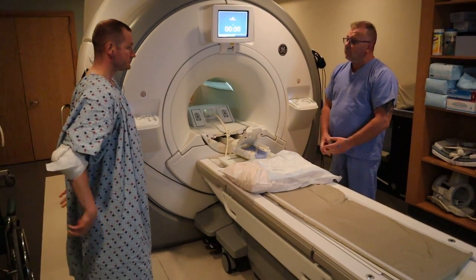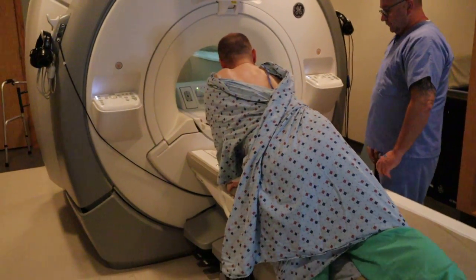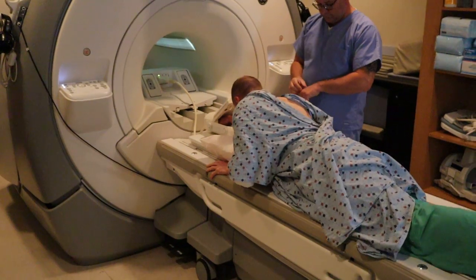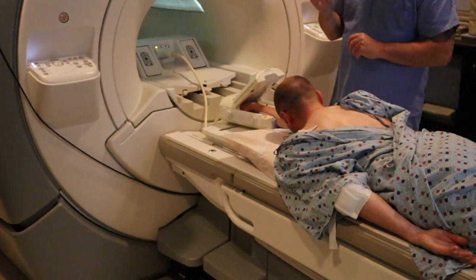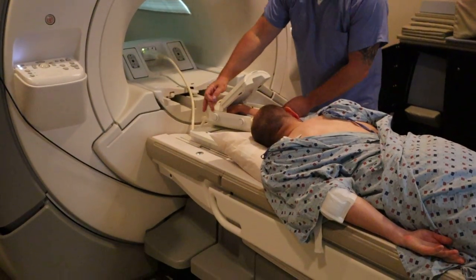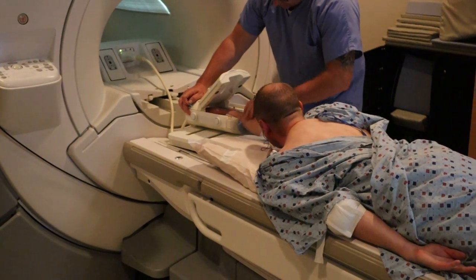The reason why is the Superman position, which is a prone position — patient on their stomach with their arm outstretched. You want to ensure that the patient's arm or wrist is not flexed or extended; you want to ensure that it's all straight on one level.